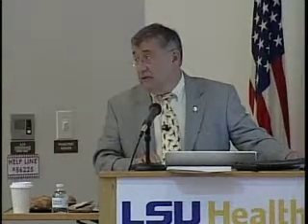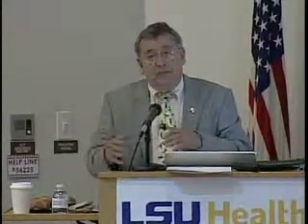Here's an SRNA who's only done sim center: 60 seconds max, and they intubate almost every patient. Residents, 30 to 50 seconds. Fellows, I actually have some of them that I have to say, stop, slow down. I want you to look around and see what the other areas are, especially if you get lost. Because if you're in the vallecula or some weird place, you recognize you're lost, you recognize where you're at.